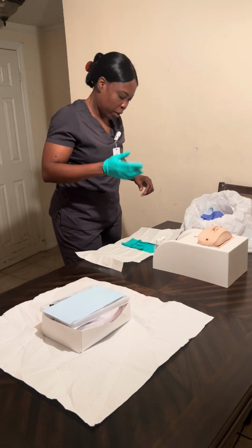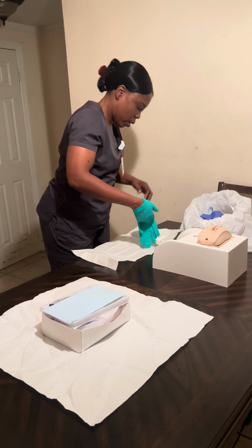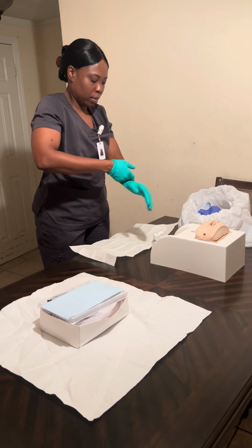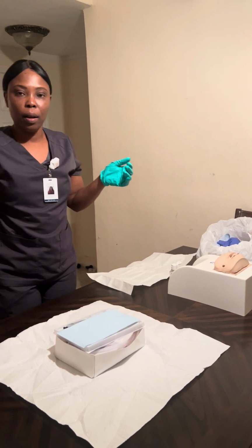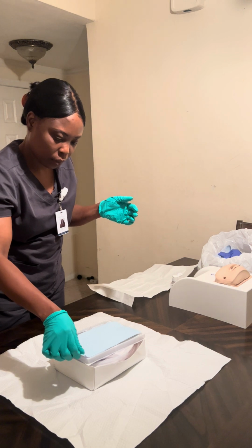I'm gonna use 4 fingers. I'm gonna make sure it doesn't touch the exposed part of the other glove. It doesn't roll up my wrist. Now I'm gonna pull my thread out.